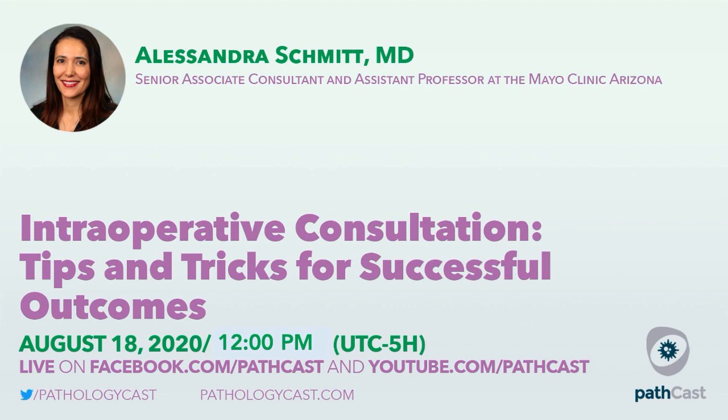The first question you should ask yourself is, how important is it for you to assess dysplasia? Is the surgeon going to act on it? Does the patient have multifocal high-grade dysplasia? Because if that's the case, he might not even act on it. So if you think he might act on it, try to focus on whether it is low-grade or high-grade. For high-grade dysplasia, I look for cytologic pleomorphy, so variation in cell sizes, okay?